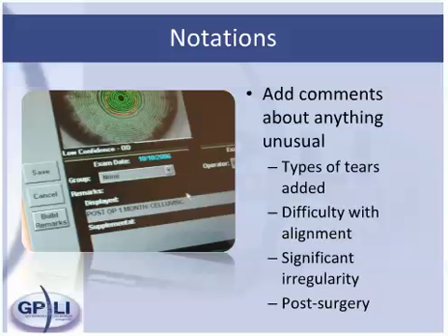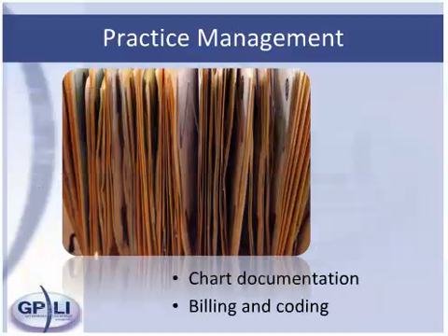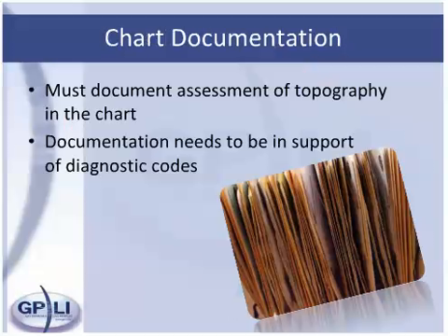Although it may seem obvious at the time that you added tears, or that the patient just took out their contact lenses, or that they're post-surgical, it may not be so obvious when you review the topographies later. There are some practice management issues to consider, including chart documentation and billing and coding. An assessment of the topography must be documented in the patient's chart, and the documentation needs to be in support of the diagnostic codes used.